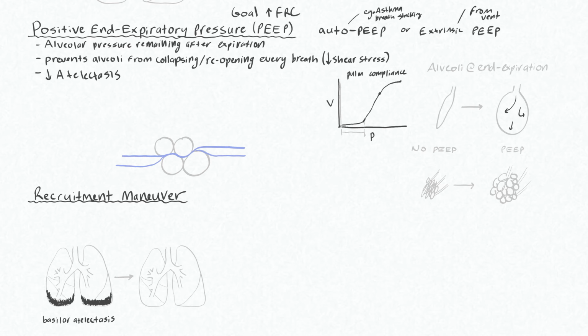Let's let this patient exhale, and this time we'll add PEEP. So instead of allowing the pressure to drop all the way to zero, we'll only let it get this far. So we have PEEP on board now. So this becomes our new starting pressure, and this is a little bit higher in terms of our starting volumes, which means that we have a higher functional residual capacity and a higher pressure at the beginning of our next breath for this person. Let's deliver now a positive pressure breath of this same magnitude, only starting at this point.